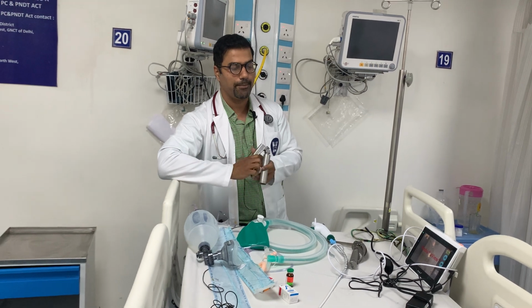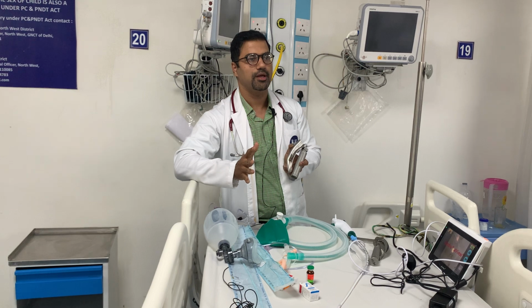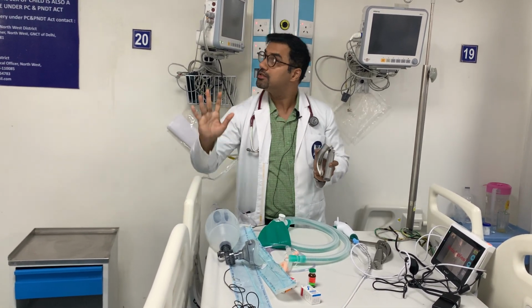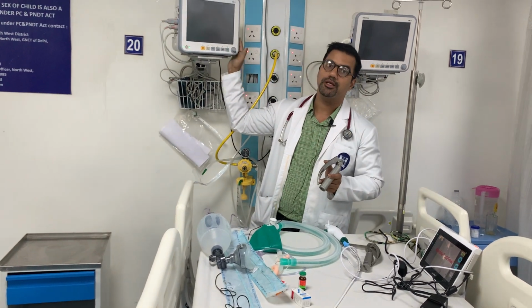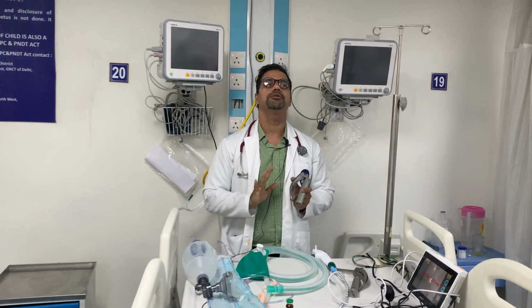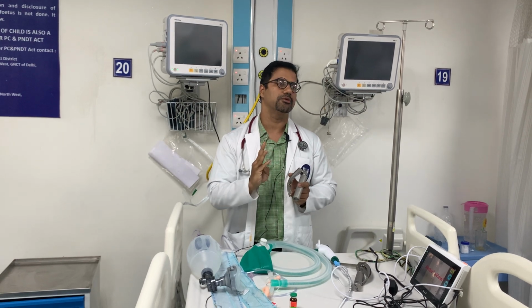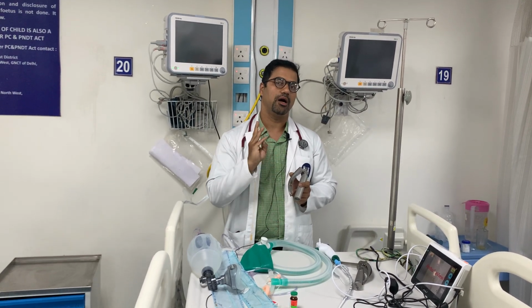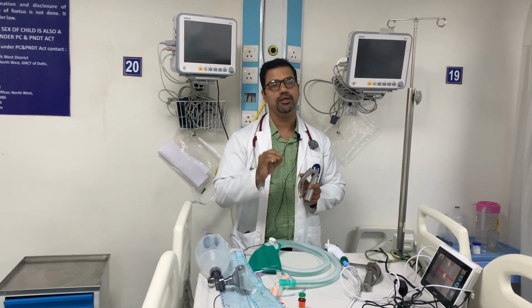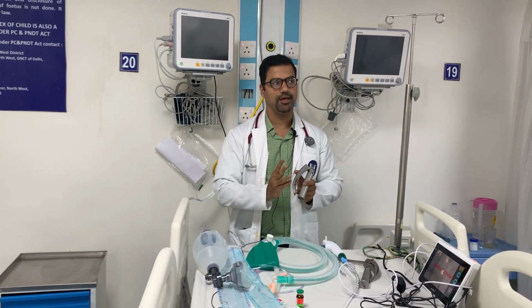Now coming to the patient. While intubating, what are the things that you should look at? The first and most important thing that I would like to tell you is this. If any patient is getting intubated and the monitor is not there, I don't think the patient is fit for intubating. You should have the proper ECG, proper saturation, proper blood pressures. After that only you go for intubation, otherwise no. Then you need to check whether any IV access is there or not. So first the monitors, then the IV access.